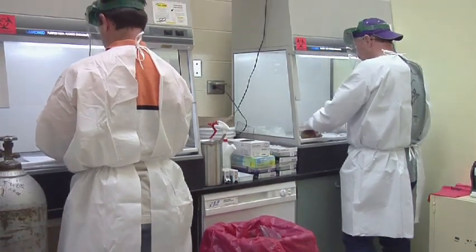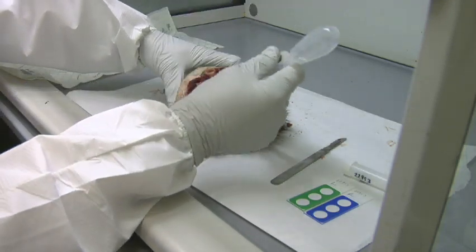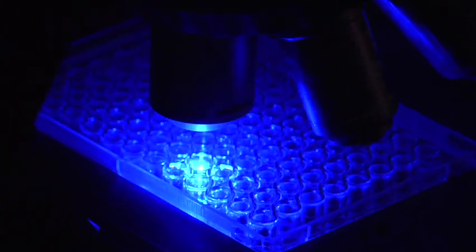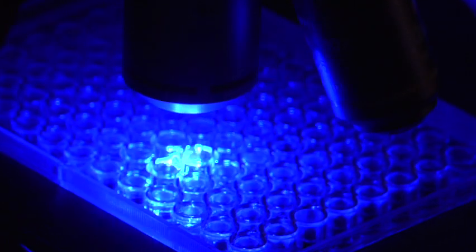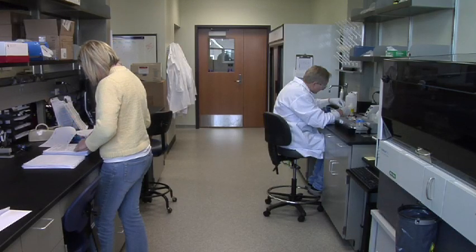The Rabies Diagnostic Lab serves as the primary rabies laboratory for Kansas and Nebraska, testing between 1,800 and 2,500 specimens annually. Using the direct fluorescent antibody method, the lab analyzes samples submitted by clients who believe they have been exposed to an infected animal. Once a person or an animal is sick with rabies, it's still virtually always fatal, so prevention is very important, and it can be prevented even after an exposure.